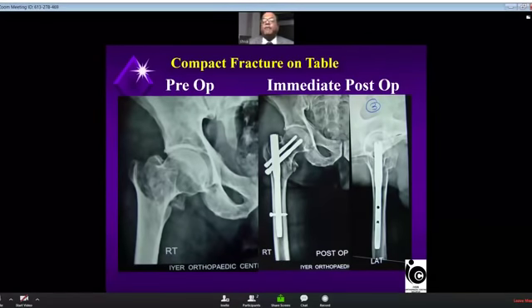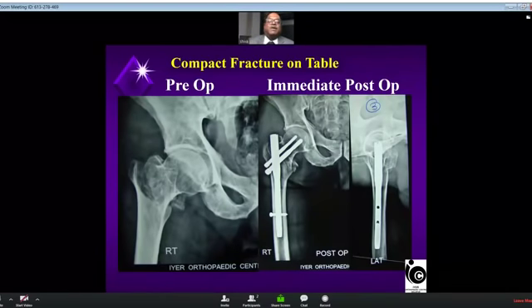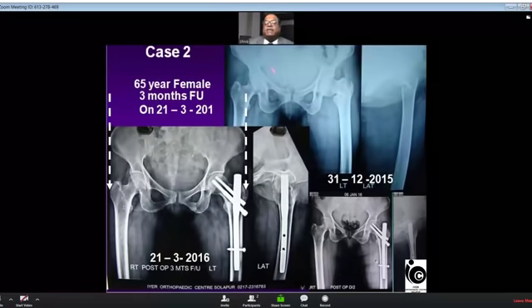That's very, very important. Sometimes due to collapse at the fracture site, the screw comes out slightly, by about 2 to 5 millimeters outside. That's fine, but that is not in our hands. But tightening on table is in our hands. So we have to judiciously compress.